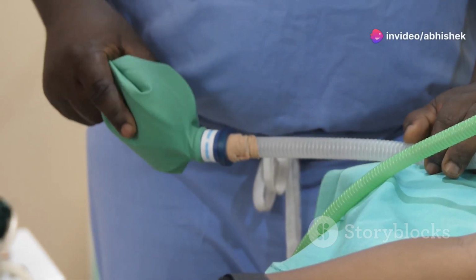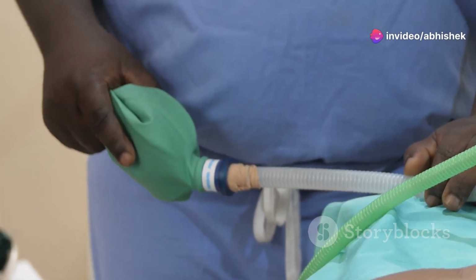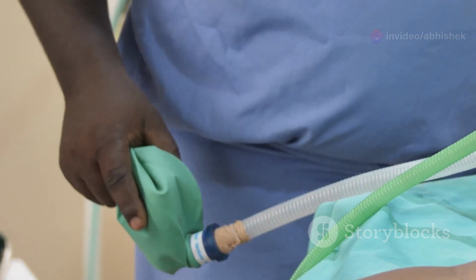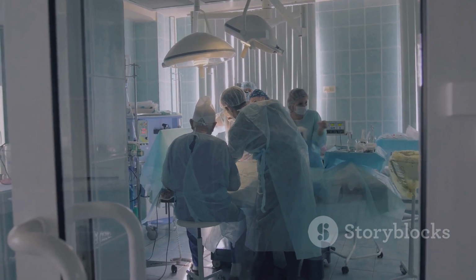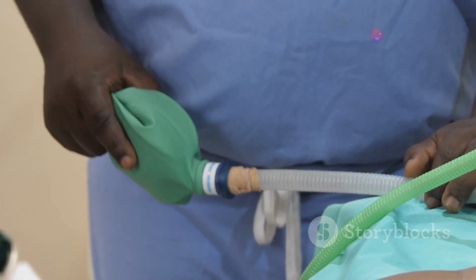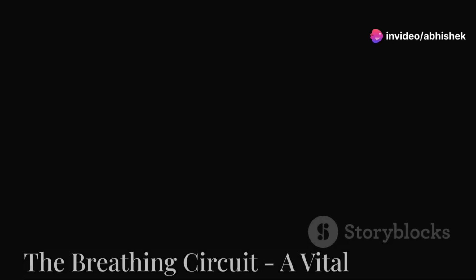The concentration of anesthetic gas needs to be carefully controlled to ensure the patient remains in a stable anesthetic state. Too much and the patient could experience complications. Too little and they might wake up during surgery. Definitely not ideal.